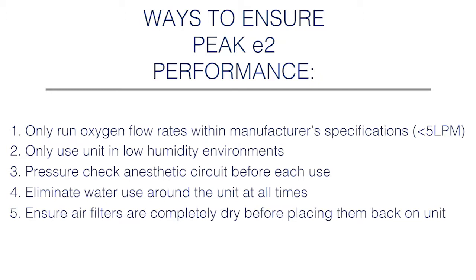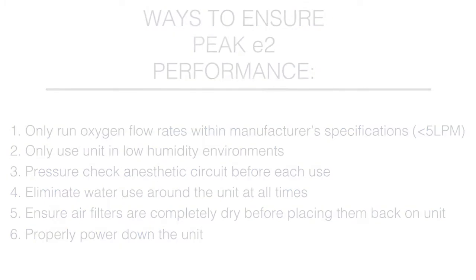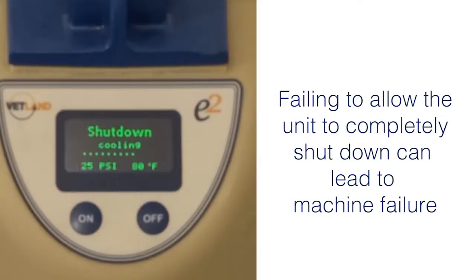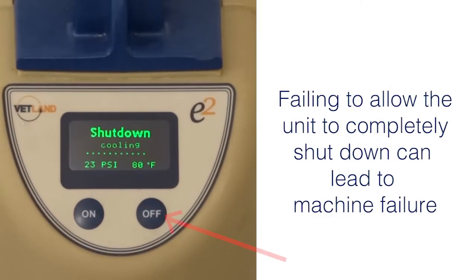Ensure air filters are completely dry before placing back onto the unit. And properly turn the unit off after use. Failing to allow the unit to completely shut down can lead to machine failures. Press and hold the off button on the right side of the screen at the end of every use.